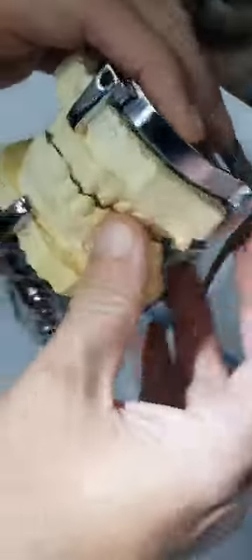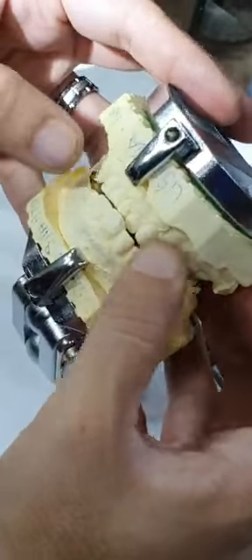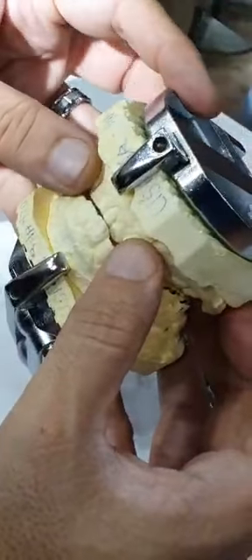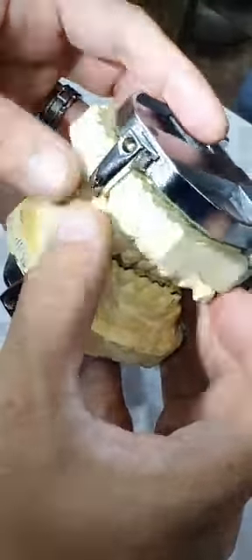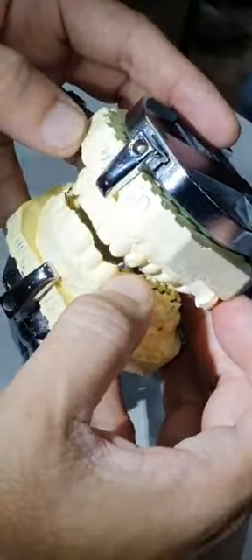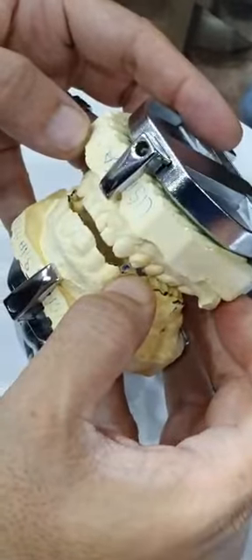Now the left side is fully balanced. Come back and prepare the right side. After making new temporaries for the right side in the lab, prep, take the impression, cement the new temporaries, and once the patient is stable, bring the crowns back and cement them. Now posterior bite on both sides — premolars and molars — has new crowns and the anterior bite is open. Go ahead and do simultaneous upper and lower canine-to-canine preps, have custom temporaries fabricated in the lab, cement those, get crowns processed, and now you have done full mouth reconstruction with bilaterally balanced and canine-guided occlusion.